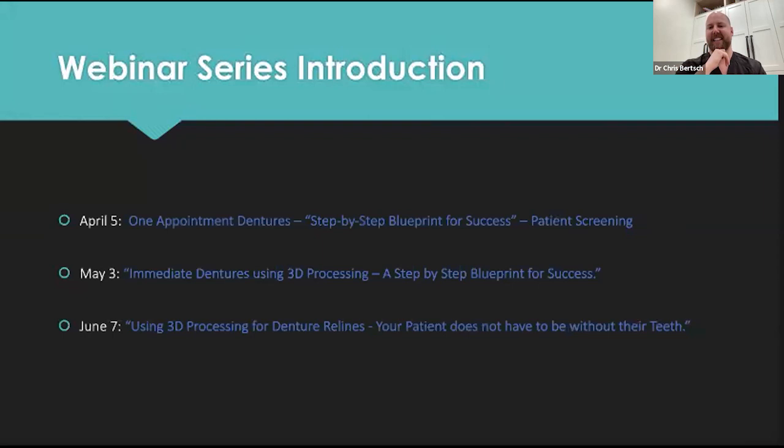So for the areas that require relief, PIP paste is the thing that I use to show anywhere the denture is burnt out. So you paint it on and it's striped, and then when you place it in, anywhere that's burnt through and you see the denture, that's an area that's going to rub the tissues and require the denture to be relieved there. So that's my interpretation of that question.